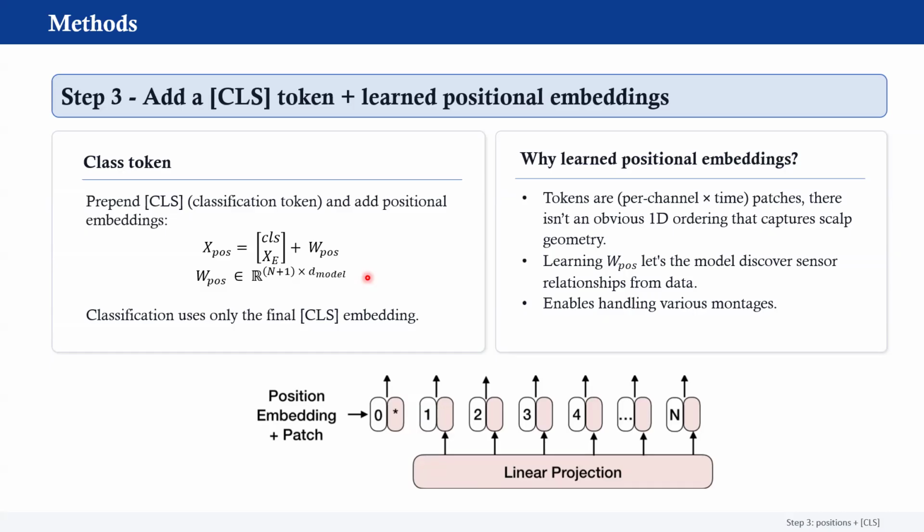It seems that this approach of letting the model learn the positional embeddings on its own seems to work. It is able to gather together and figure out that these channels are positionally close to each other. A reason for that can be that in EEG, generally sensors are close to each other, right?